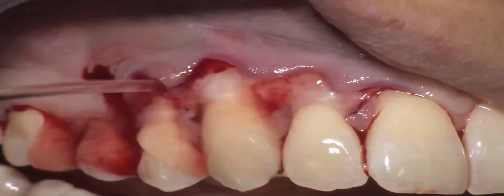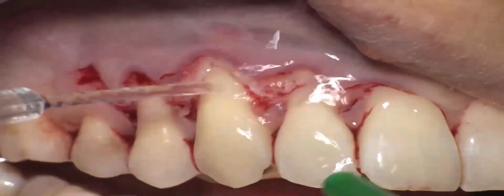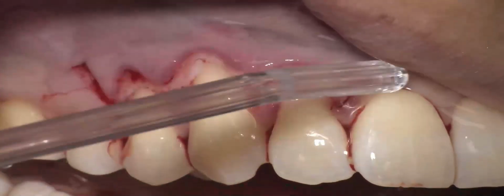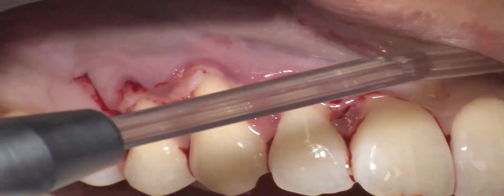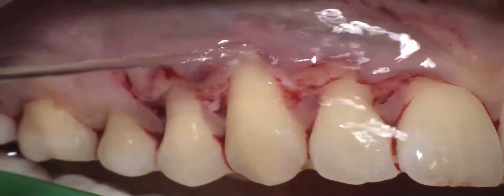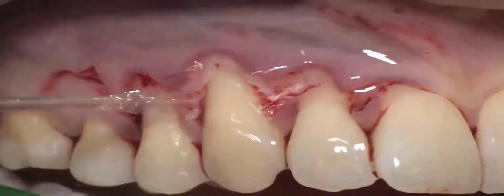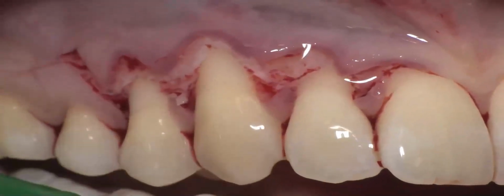Now we are rinsing a lot, for about 1 minute, in order to remove all remnants of EDTA at the level of the root.